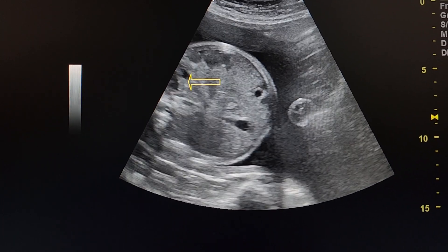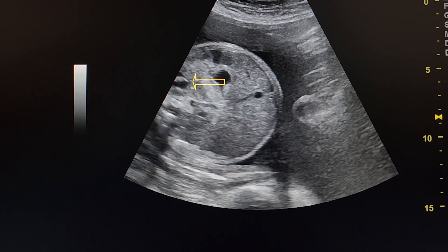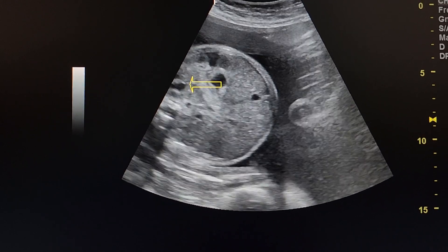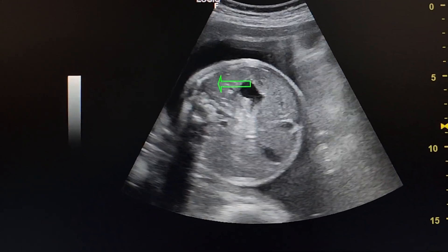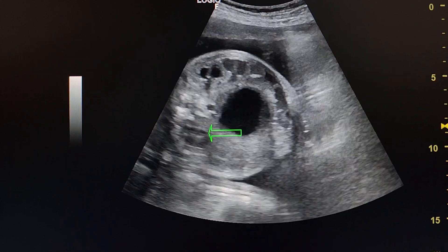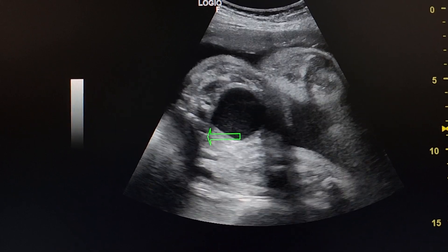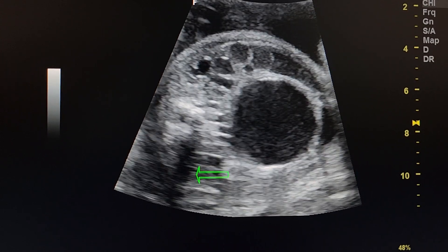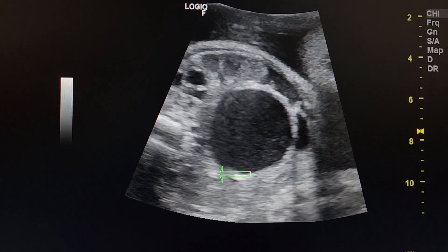Here we see the left kidney, which is dilated, and this is the right kidney. Here is the dilated left kidney, and the right kidney, which is less evident.